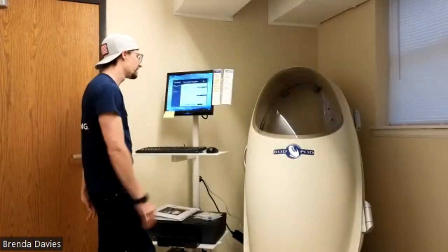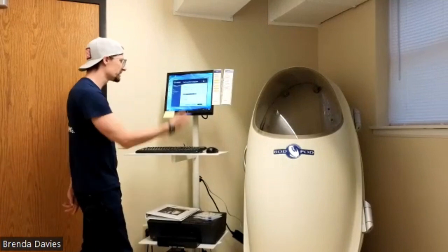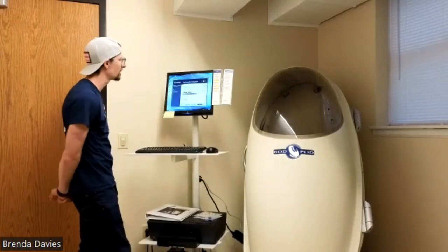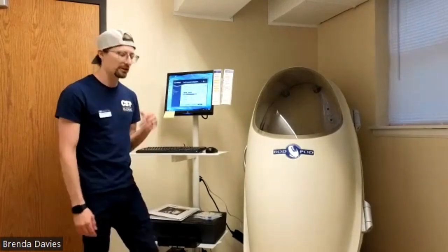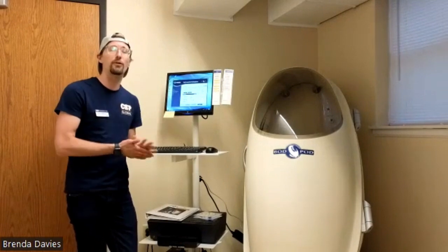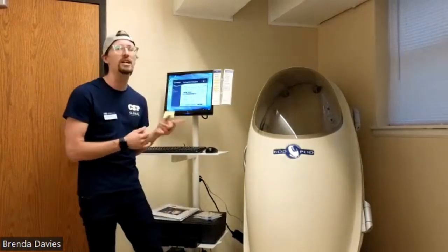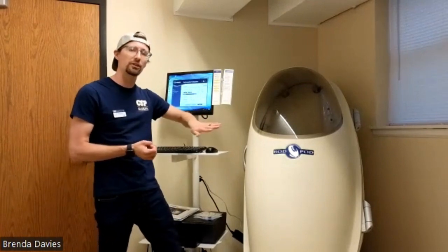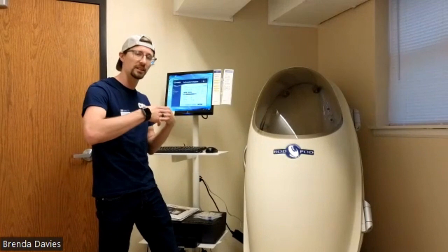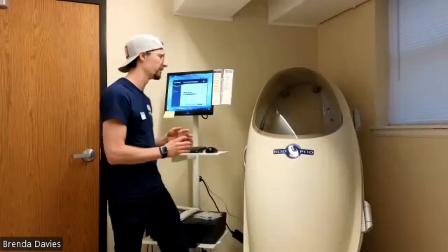We can review that information next. It's full printouts that you could have coming from the computer. And it will also estimate what your resting metabolic rate is. If you have had me in a nutrition class for the doctorate program, really in ex-phys classes, I love talking about resting metabolic rate, because that's the baseline energy expenditure that someone would have to consume to not lose any weight if they did nothing for a 24-hour period.